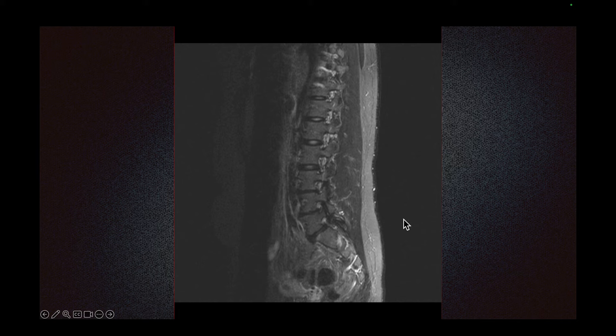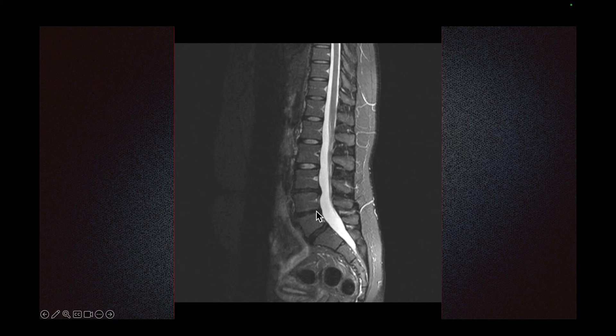Fracture of the pars is also called spondylolysis. If there is movement of the vertebral body — anterior listhesis — we call that spondylolisthesis. In young patients, spondylolisthesis occurs mainly after fractures. In older people, spondylolisthesis can occur from arthritis of the facet joint without a fracture. As we scroll through the image, we do see mild anterior listhesis of L5 on S1. So this case has both spondylolysis and spondylolisthesis.